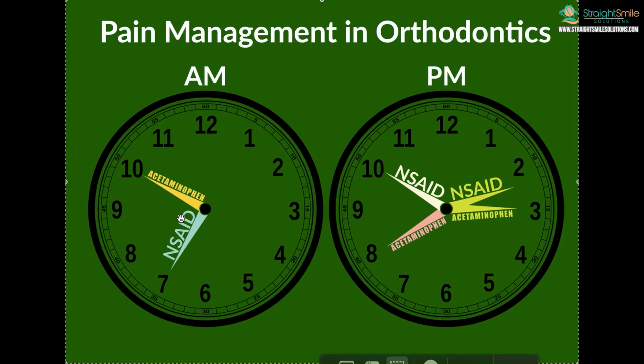With aligners, you're gonna be changing aligners every 1 to 2 weeks. So it's a little bit more frequent, but your discomfort should be way less in aligners. You probably don't even need to do this in aligners, but there's always a few people who are very sensitive. And that's really gonna depend on the trim of the aligner, the thickness of the aligner, and how much movement they've programmed into each aligner. And that's not something I can tell by looking necessarily at your aligner. Anyways, so let's take you through a typical day.